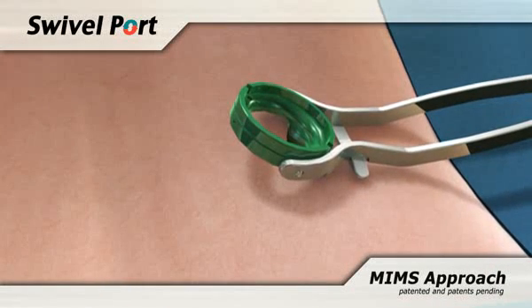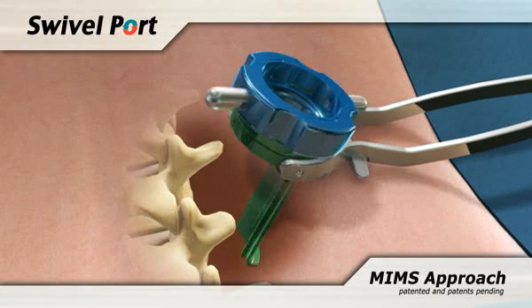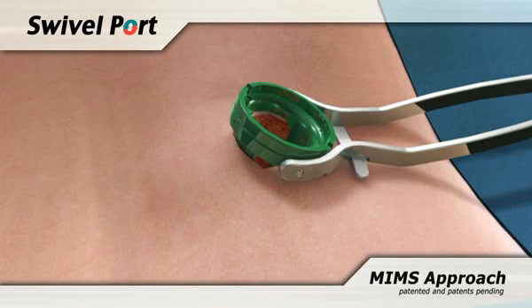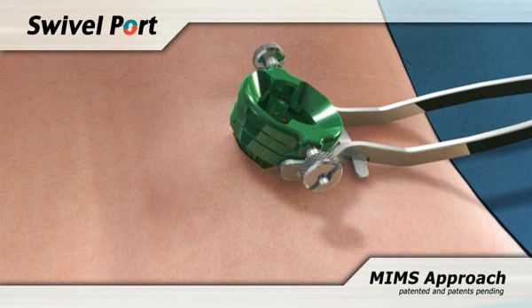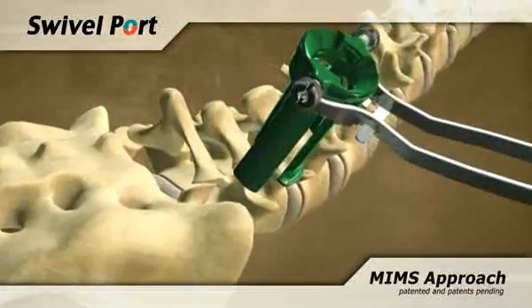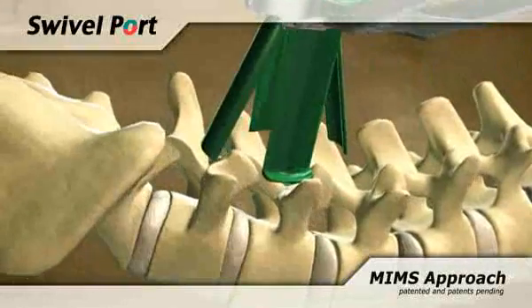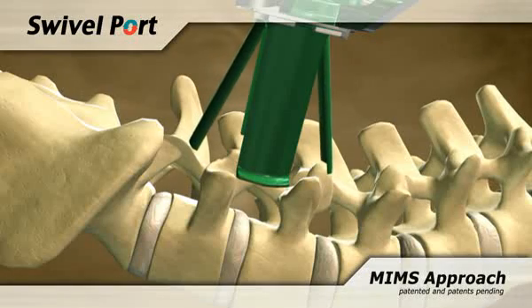Attach the rotating ring and open the swivel port base by turning the ring clockwise. Remove the rotating ring and insert the closed expander blades into the port with rostral caudal orientation, opening the blades as needed with the wrench or screwdriver. Caution should be taken not to overextend the blades. If a bony structure causes resistance, a slight adjustment to the blade angle or a different blade length may be needed.